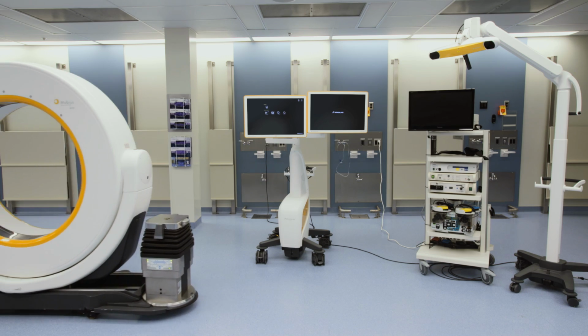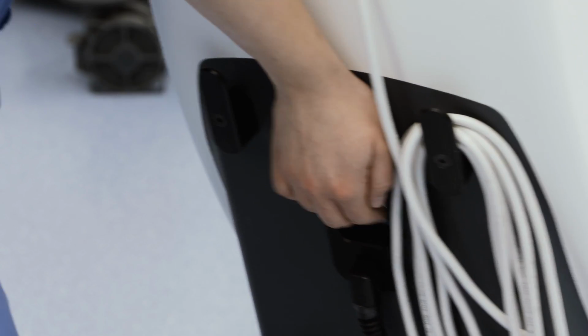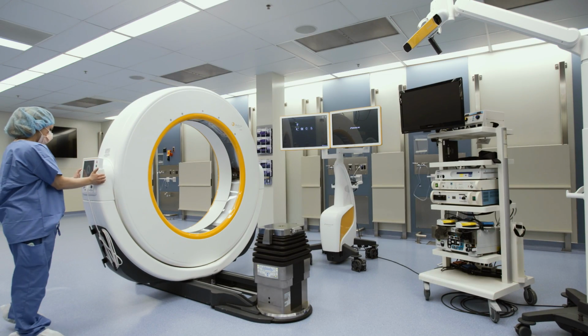The first step is that the CT tech actually brings the scanner in. In our situation, they bring it in the night before. And we have marks on the floor in terms of whether it's head first or feet first, and I post it appropriately. So generally the table and the scanner are in the room while the nurses are setting up.